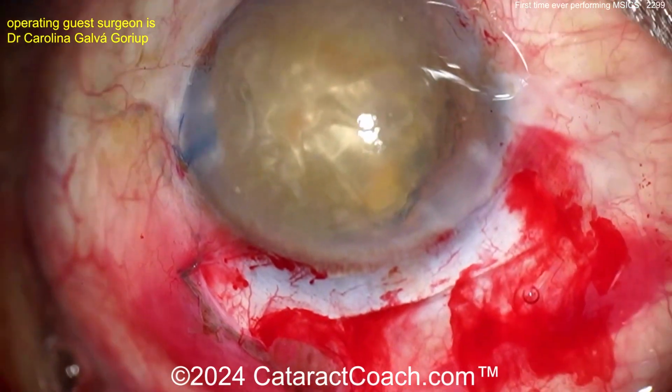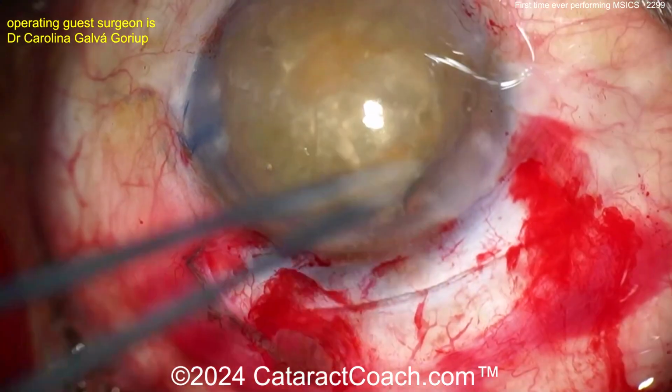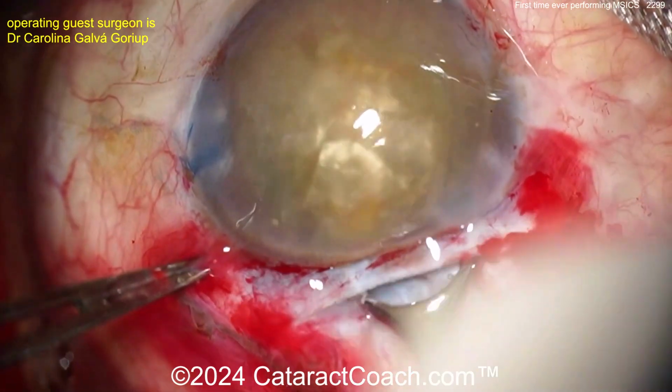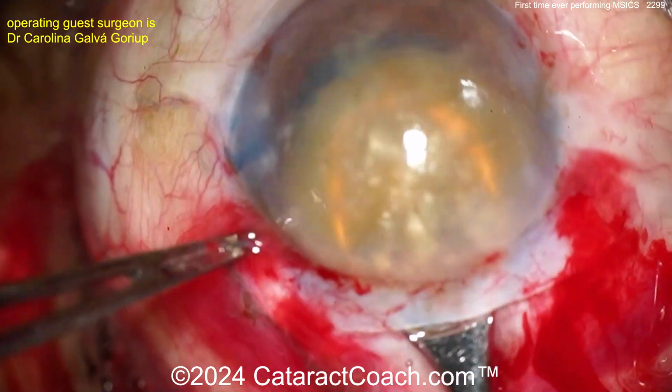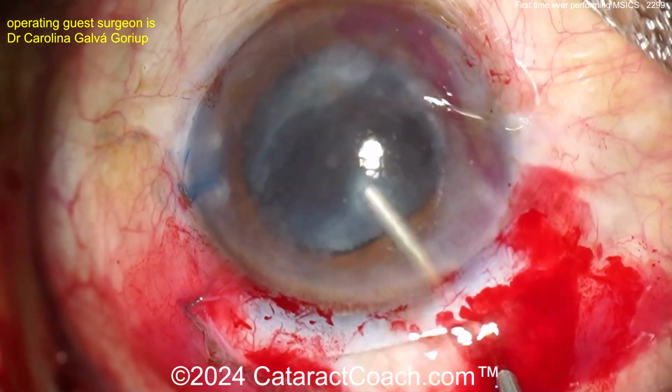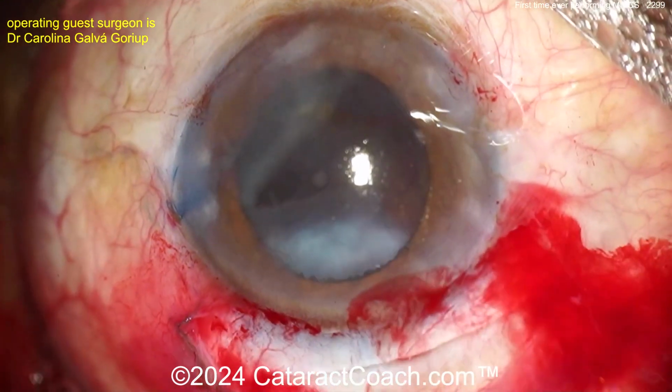Here's more viscoelastic behind the nucleus and in front of it. And now let's get that lens out. Deliver this baby. Here comes the lens loop. Do not lift against the endothelium. Just pull straight out. There it is. Beautifully done. Very nice. You put some viscoelastic there to keep the eye formed.